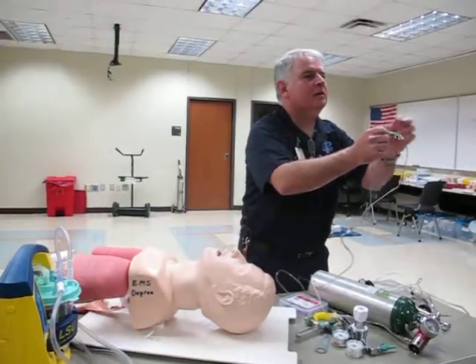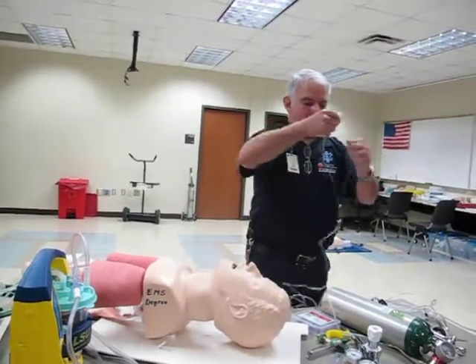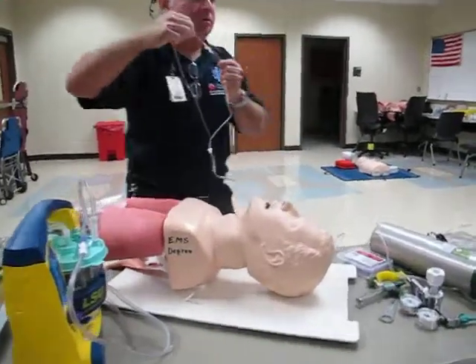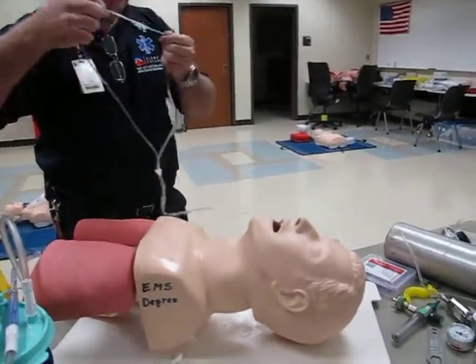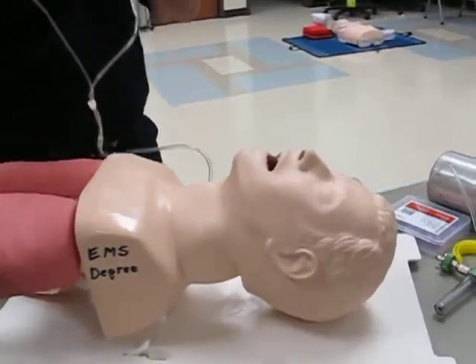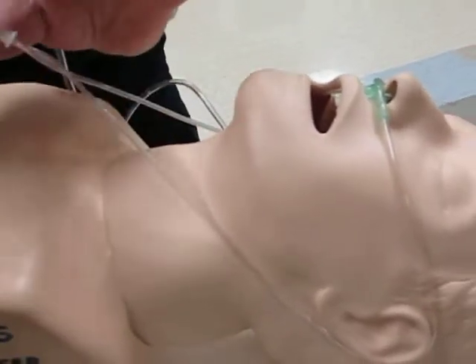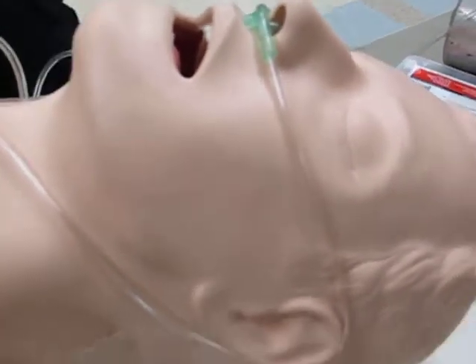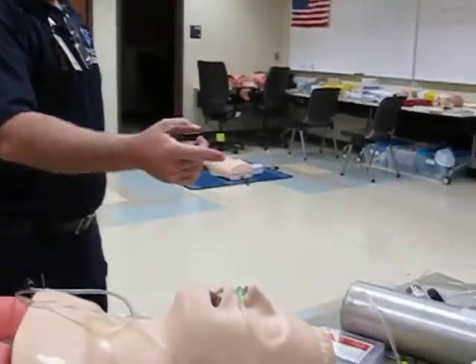This goes in the nose. This little tab right here goes in that little divot on your top lip right under your nose. The best way to put this on is to approach the patient from the belt line heading up to the head — set this little tab down because it goes in the divot and these go in the nose. Tell them what you're doing first: 'I'm going to give you some oxygen — this should help you breathe a little better.' It goes in the nose, in the divot, around the ears. That's what hooks it. Grab the little adjuster here and just snug it so it won't pop off.